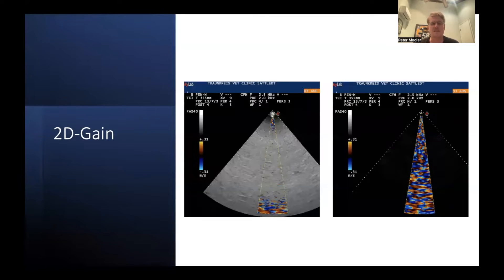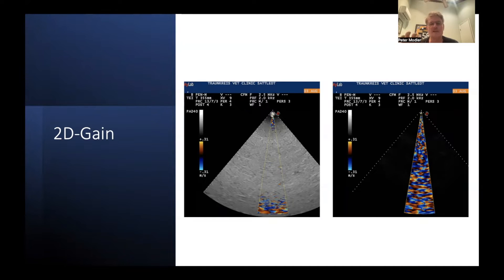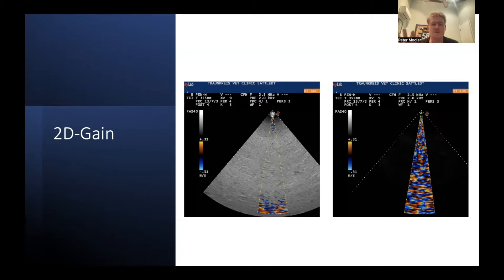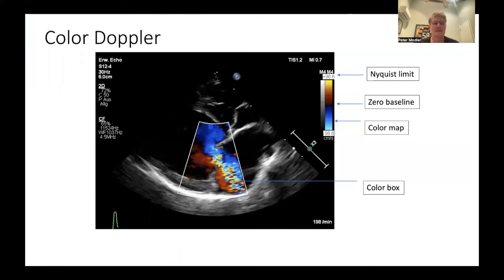What about the 2D gain? The gain is always like the volume of your radio — if you turn it up you get a lot of signal, if you turn it down the signal is weak. So if you turn up the 2D grayscale gain of your machine, you will see a lot of gray image. The blood will be gray as well, the myocardium will be very bright. It's important to know that gray pixels cannot be colored, so the more grayish the image is, the more diffuse the color will be. Always try to adjust the gain so you see the blood in black and the myocardium in gray.